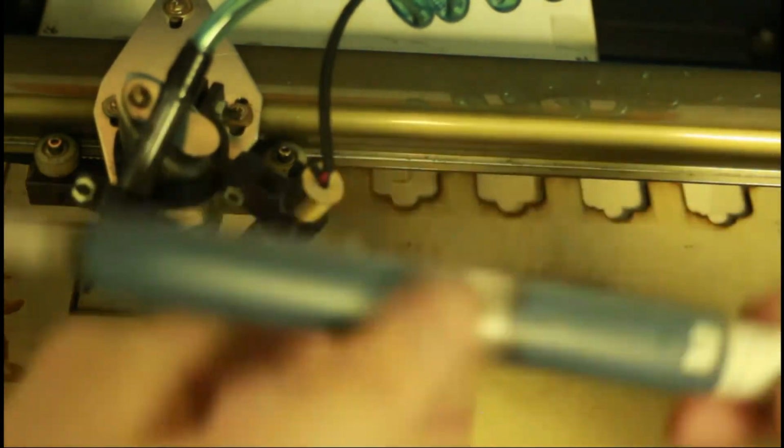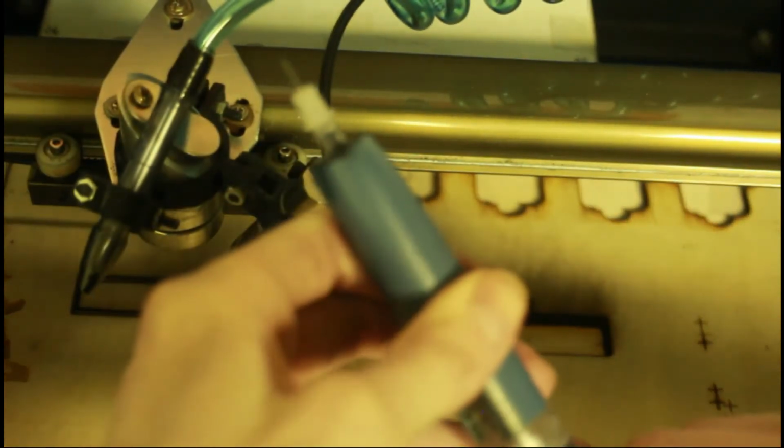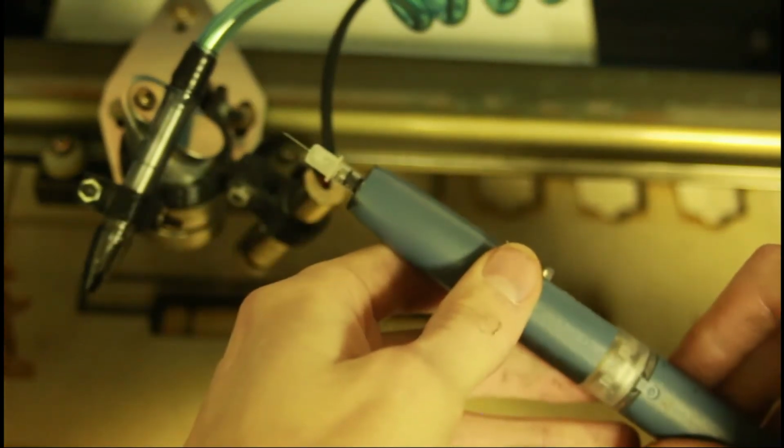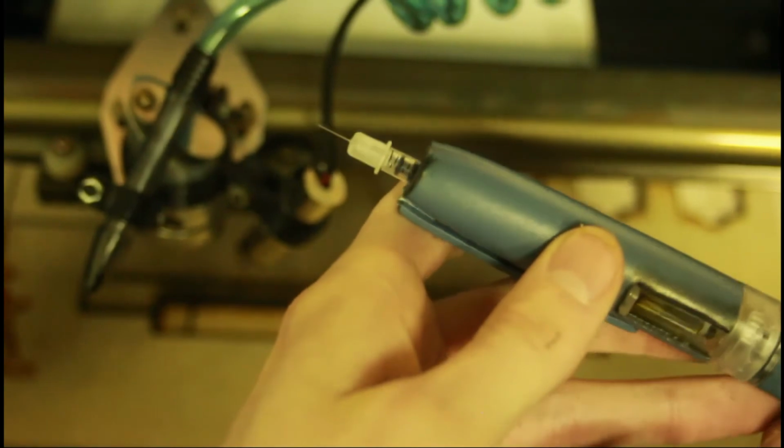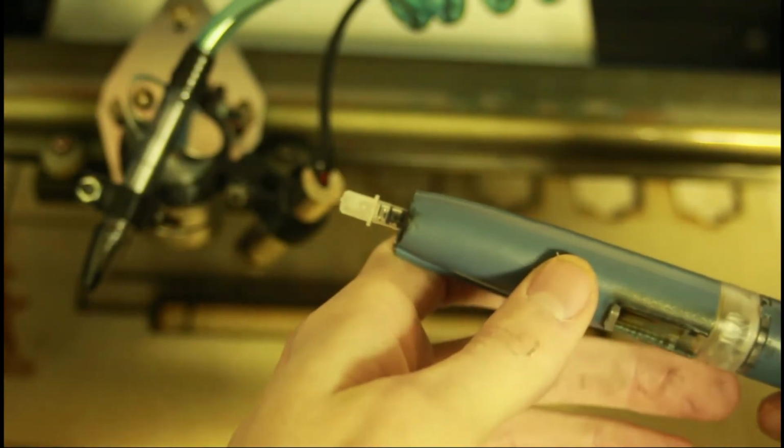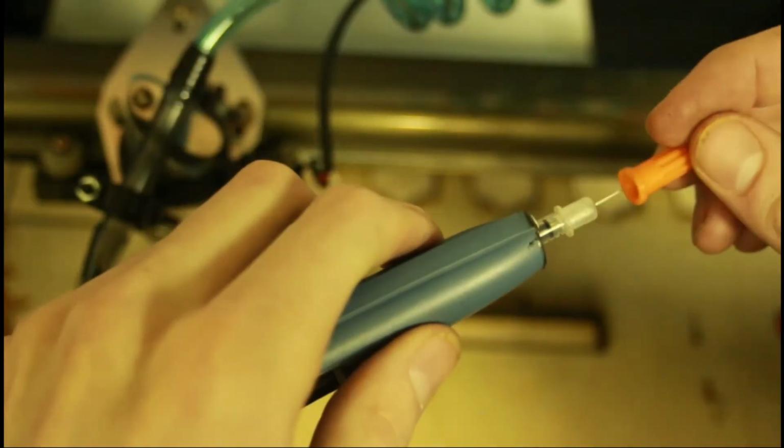There we go. And let's push it in. And when you look at that, it goes exactly to 1.5 units. Is that not incredible? So that's how it works. That's how it's made. That's the whole show, everyone.